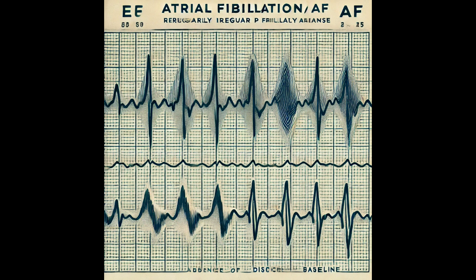Yikes. So how do we actually see this musical mayhem happening on an ECG? Good question. The lecture points out a few key signs. The first one is missing P waves. Normally, those show you the organized activity coming from the sinus node, the conductor. So when they're gone, it's like an empty podium. Nobody's leading the orchestra. Makes sense. What else do we look for?